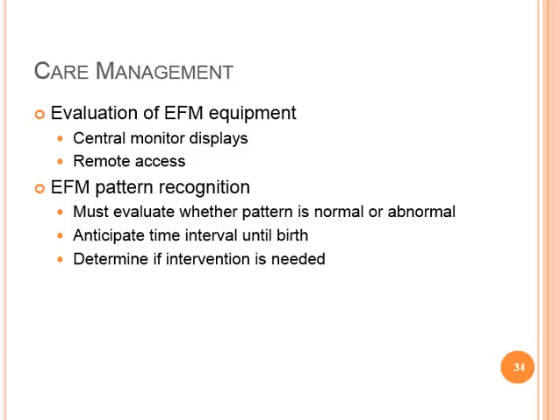If you cannot determine what the baby's doing with the external monitor, you can either ask the physician or the midwife, or in most institutions, nurses can place internal fetal monitoring as long as there are no contraindications, such as if I had a mom who was HIV positive, we would not put internal monitors in that mom.